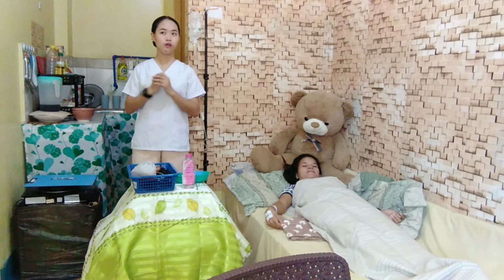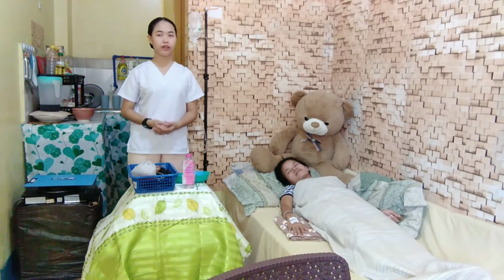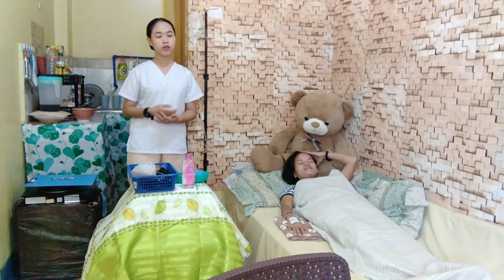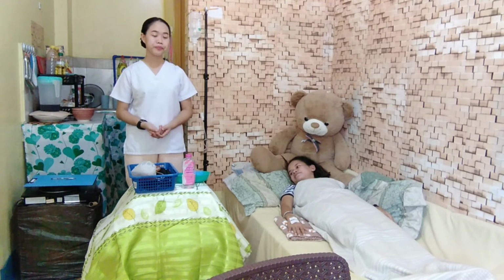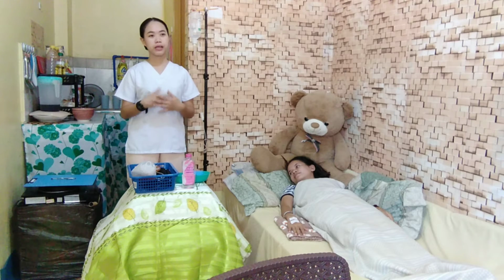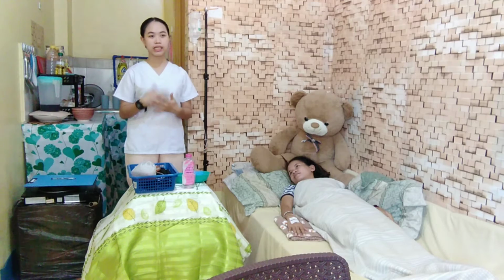The purpose of blood transfusion is to replace the blood loss of a patient who undergoes surgery or operations or has injuries. Blood transfusion is also done as part of treatment for patients who have certain illnesses.